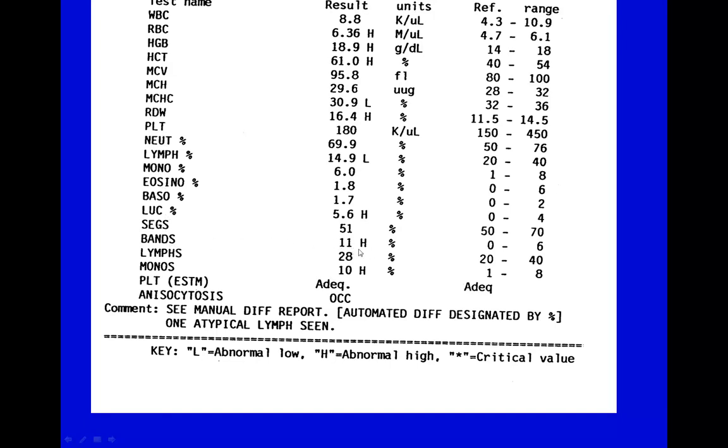Do you remember the name of that? The term we might see in a patient's chart or the physician's writing, it might say there's a left shift. Do you remember a left shift means that you probably have an acute infection? And what are those bands going to grow up and become in the next few hours? They'll become segs. So if we report this laboratory test in a few hours, we may have fewer bands and more segs as those have grown up. Or what if the condition is still happening? We're still going to have a high band count, and now we have a high seg count.